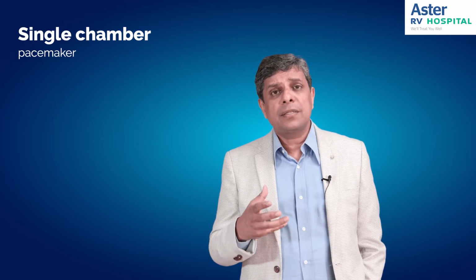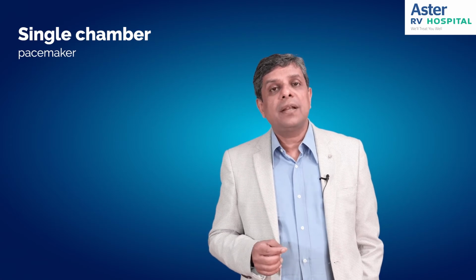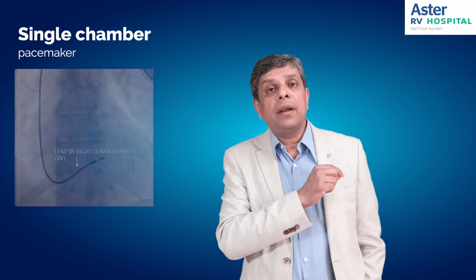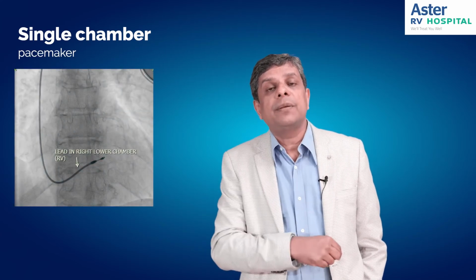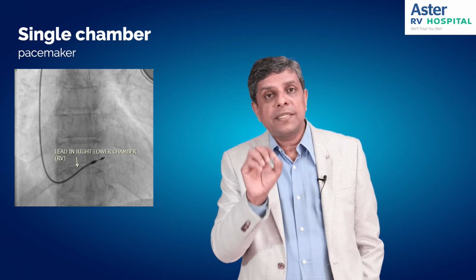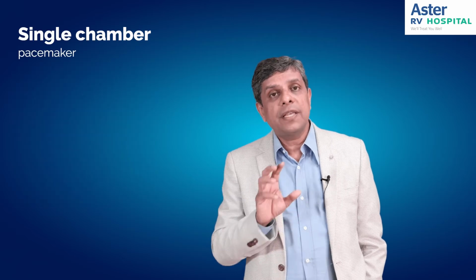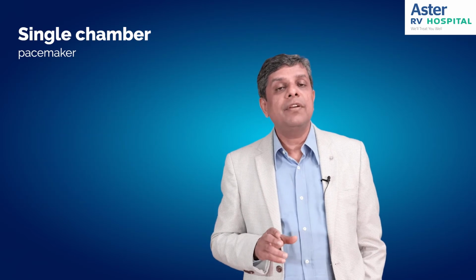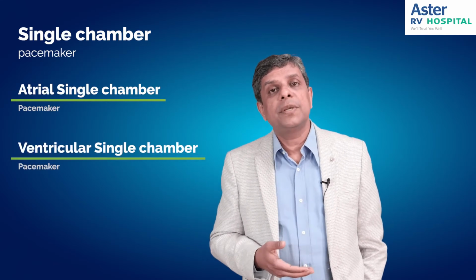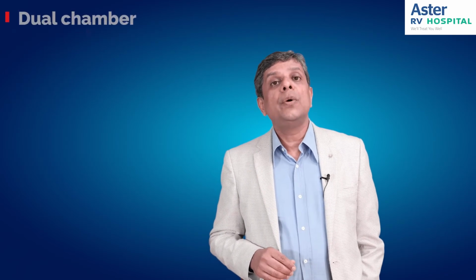Similarly, there are some conditions where the pulse rate is very irregular, and because of that the pulse becomes slow as well. At that time, we implant a single wire into the lower chamber called the ventricle. So this single chamber pacing is sufficient in a patient who is elderly and has an irregular pulse rate. So this again is called a single chamber pacemaker. So you could have an atrial single chamber pacemaker for the upper chamber or a ventricular single chamber pacemaker for the lower chamber. The second type of pacemaker is called a dual chamber pacemaker.